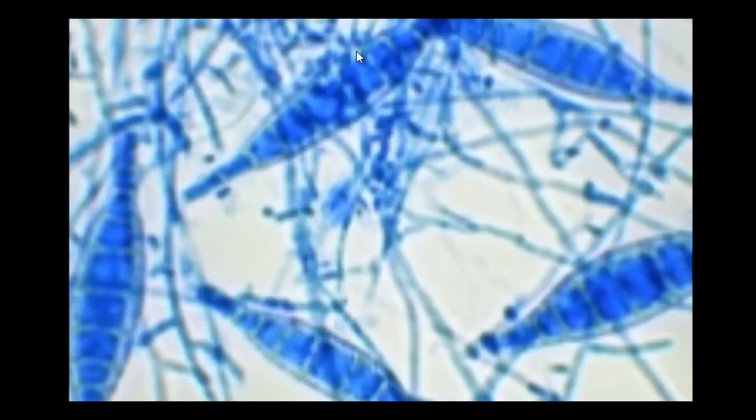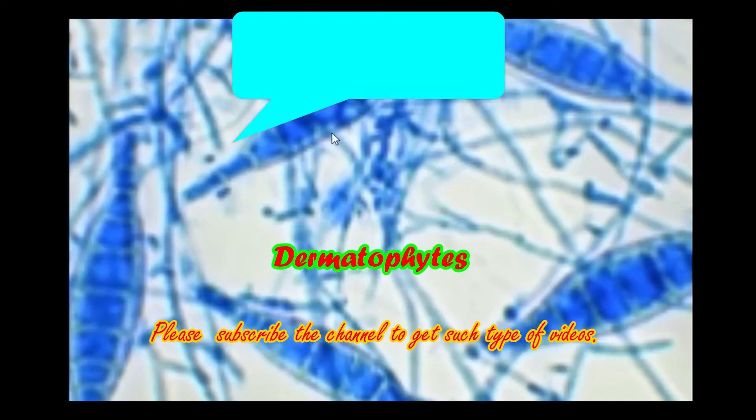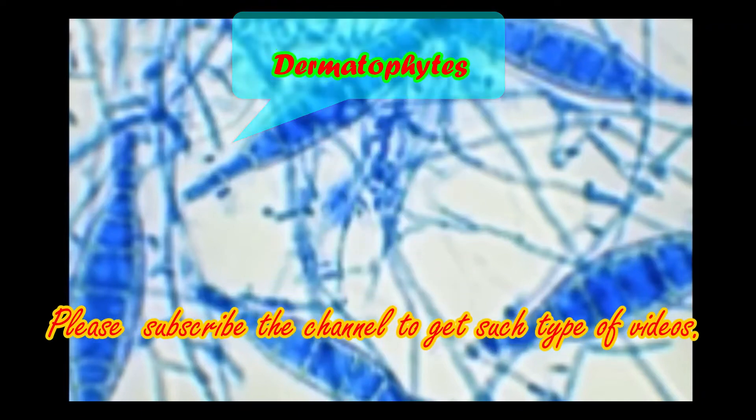Here you can see cotton-like pigmented colonies. Now let's try to observe the spores — here you can see scanty spores. And about macroconidia, spindle shape — this one, spindle shape. In this way we can identify Microsporum.